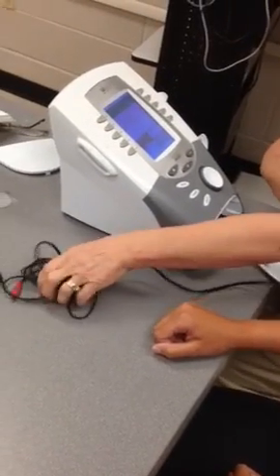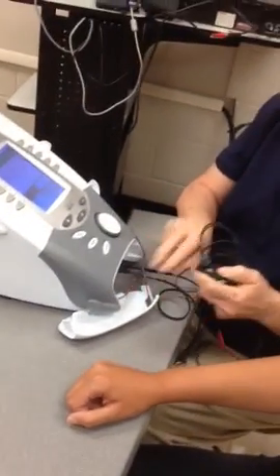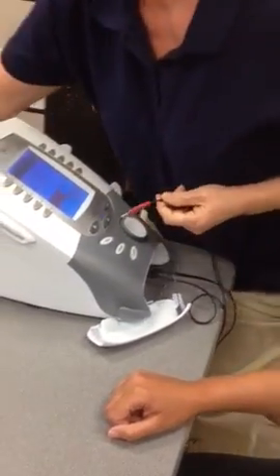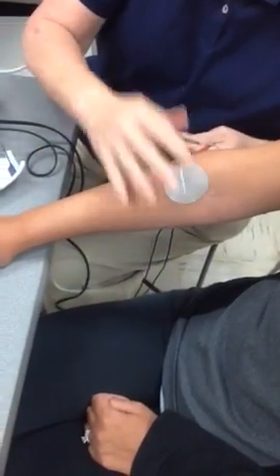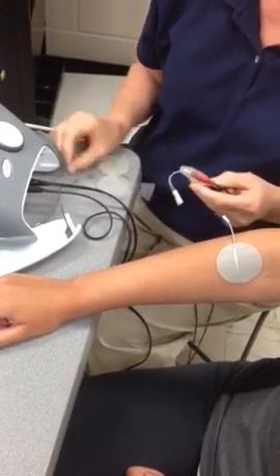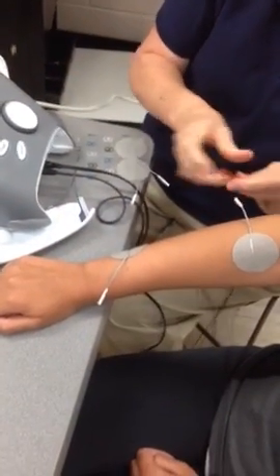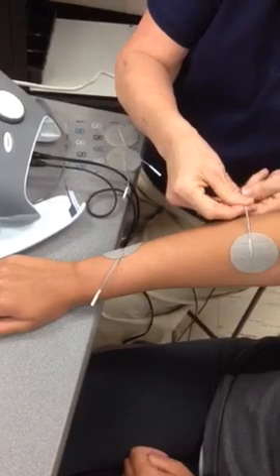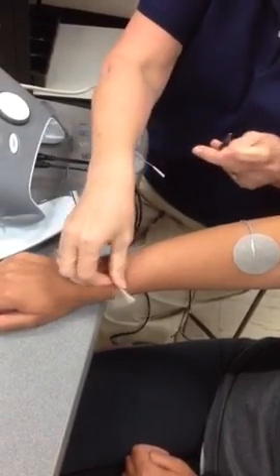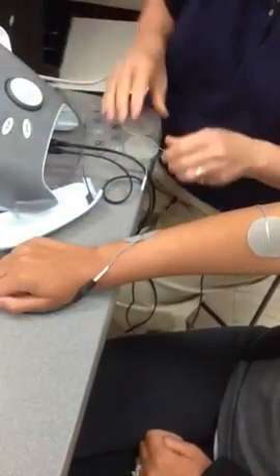And we're going to assume for this video that we've already cleaned the area of the skin with the alcohol wipe. All right, so we're going to crisscross our electrodes. So we may have one there, and then here. And with interferential, the current's going back and forth, so you don't necessarily have a positive or a negative electrode.